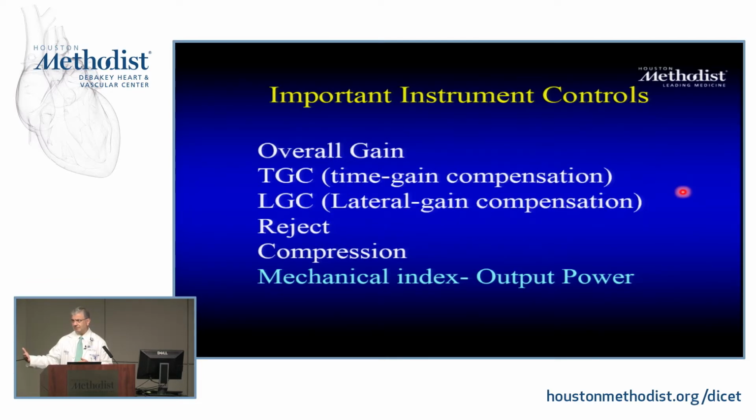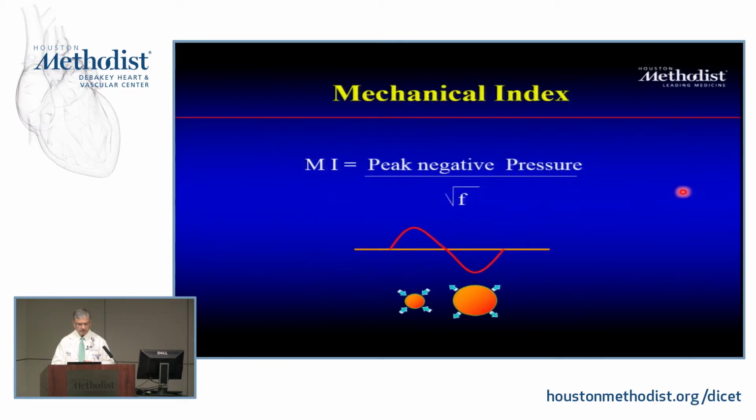Destructive. You could break down red cells, you could injure tissue, we know that, and you use it in different other biological implications for that. You could have lithotripsy with ultrasound, right? You can focus the beam and then have so much energy to destroy anything that you want to do. So it is regulated within a certain range that's important from a safety point of view.